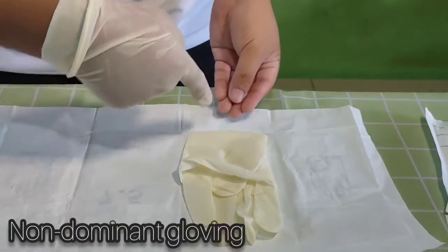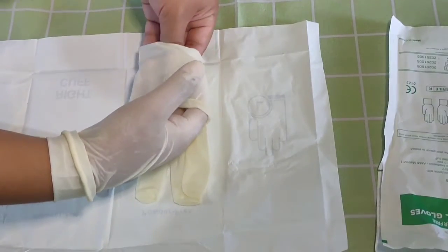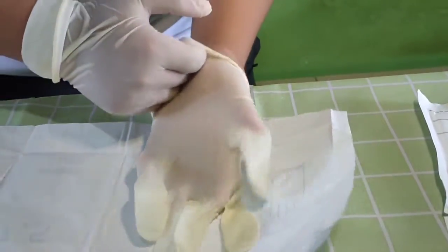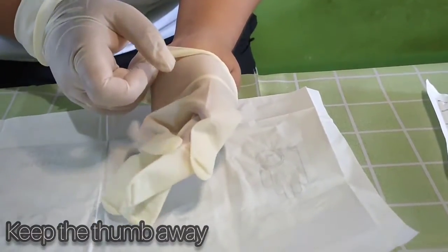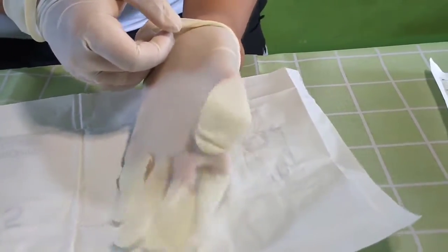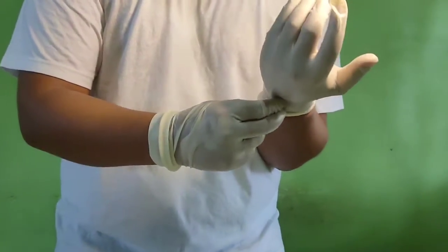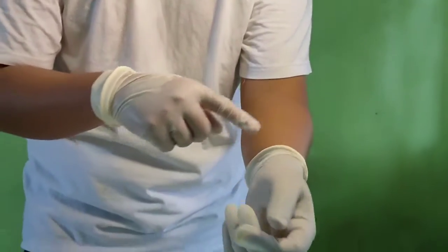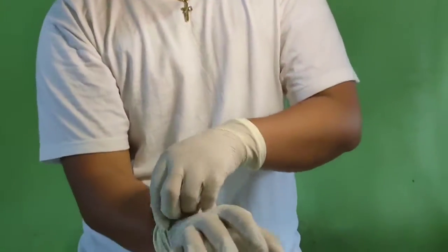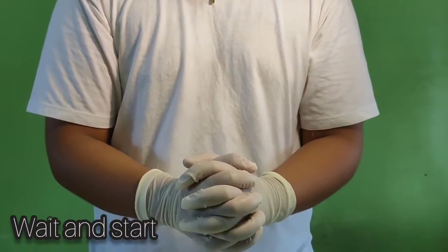For the non-dominant glove, you're going to slide two fingers underneath the cuff that's folded over and gently insert the other hand into the glove. It's also important to keep your thumb away so you're not tempted to use your thumb to touch the inside of the non-dominant glove. Now that both hands have been gloved, you can go ahead and adjust the fingers as you need to. Always remember, avoid touching the skin. Once finished, wait for the operation to begin.